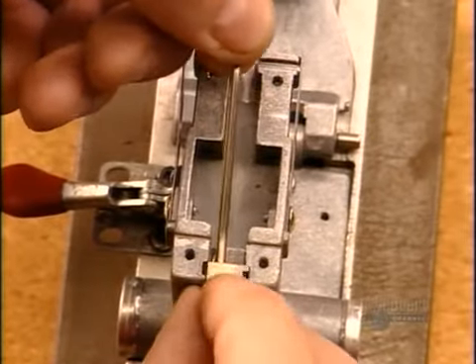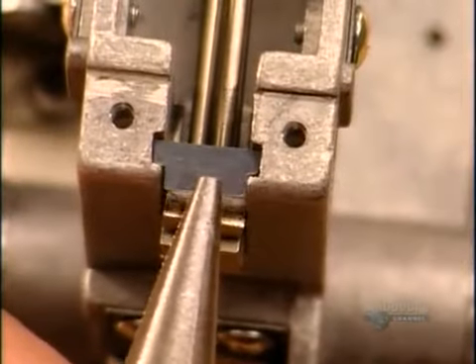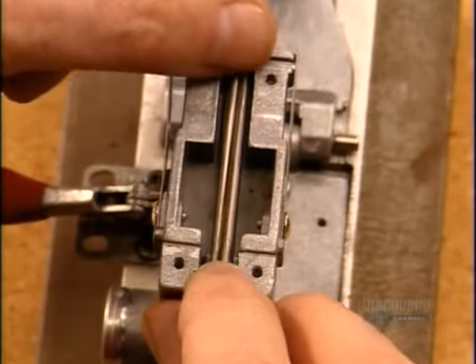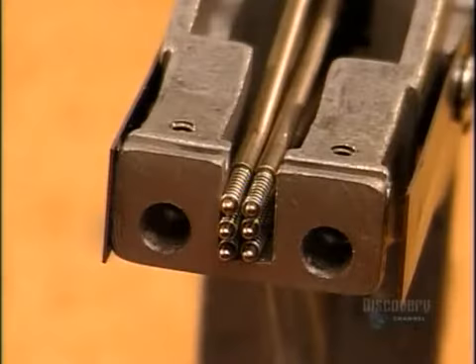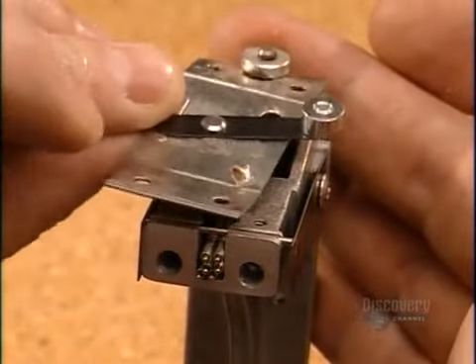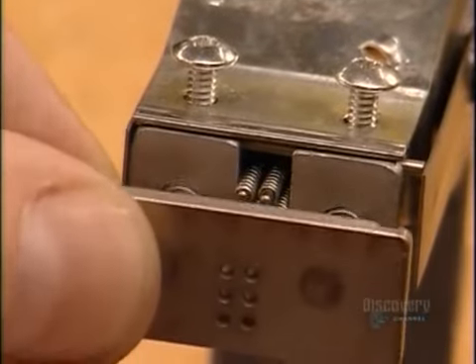To build a Braille writer, they first position the six styli, one by one, in a carriage, with steel spacers in between. The spacers ensure the styli move freely. A cover plate seals the back of the carriage, and what's called a stripper plate closes the top.